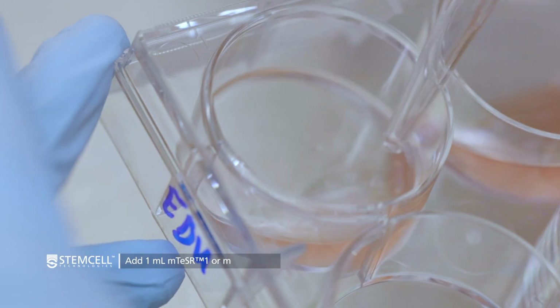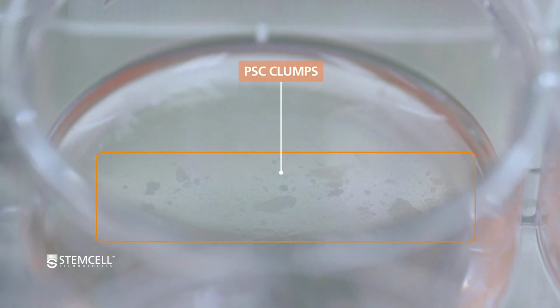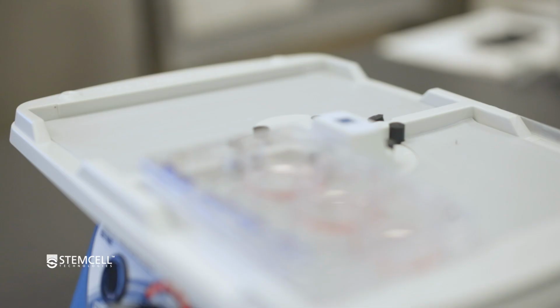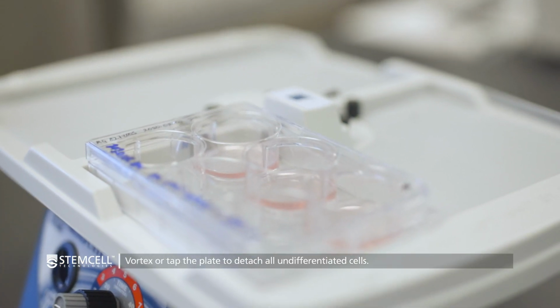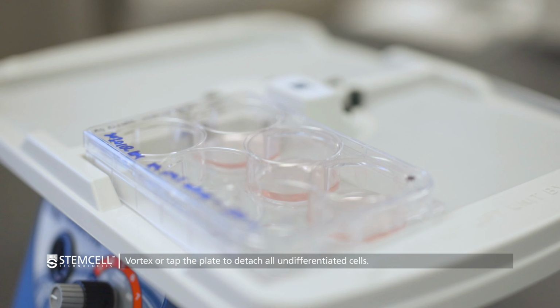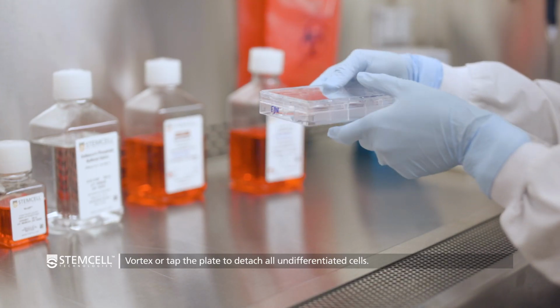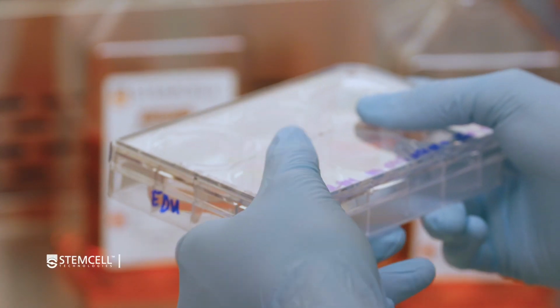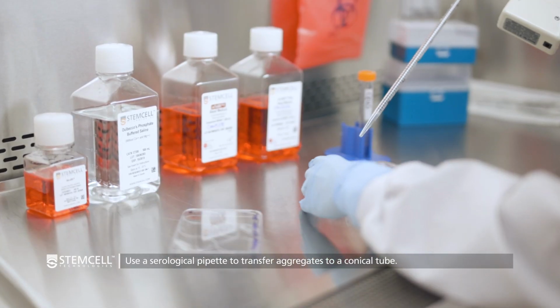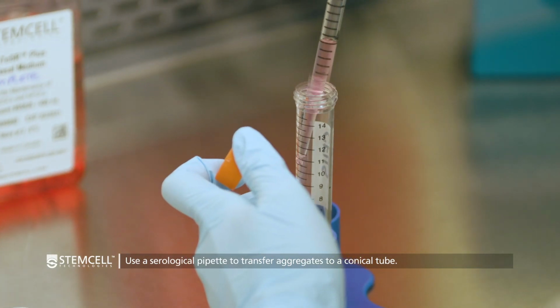Once the incubation time is over, remove the plate from the incubator and add 1 milliliter of mTeSR1 or mTeSR Plus to the well. You will immediately see the undifferentiated PSC clumps lift off the bottom of the well. To detach the undifferentiated PSCs, place the plate on a plate vortexer for 2 to 3 minutes at 1200 RPM at room temperature, or manually tap the side of the plate using the base of your palm for 30 to 60 seconds. Using a 5 milliliter serological pipette, transfer the detached cell aggregates to a 15 milliliter conical tube.